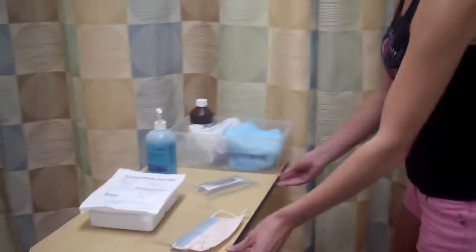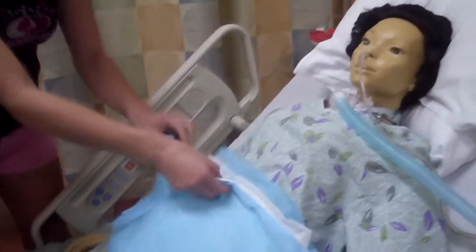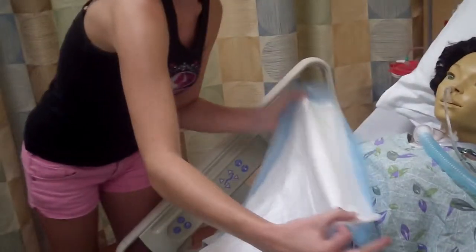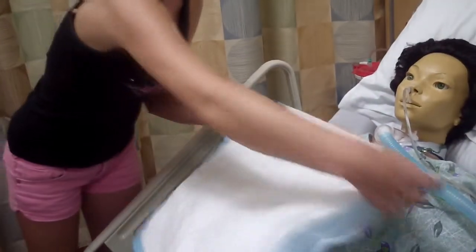I'm going to bring my supplies over. Place my trash within reach. Put an absorbent pad on Miss Jones' chest. Keep her dry from any secretions.